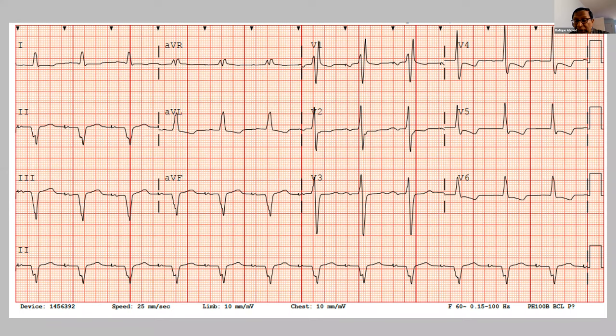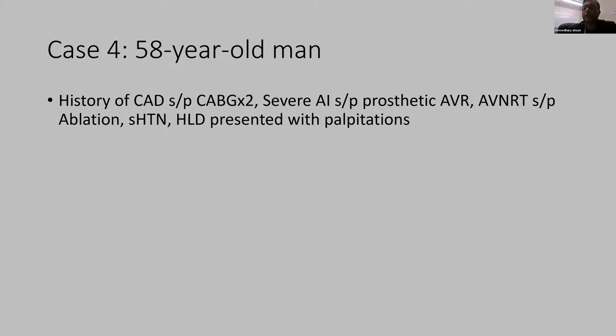Question, yes. As you said, Hafiz, you put 3 points. Does all AV dissociation mean AV block? No. Right, exactly. There can be competing rhythm. I think there is some competing rhythm, as Tushar pointed out, that the relationship between the P and QRS complex is changing a little bit. And if we had waited long enough on this rhythm strip, we would probably find in some place there will be some conducted P wave. Yeah. So good academic discussion, but the patient did fine.